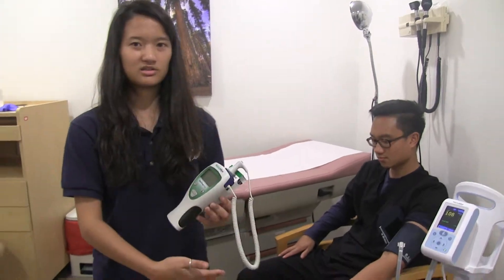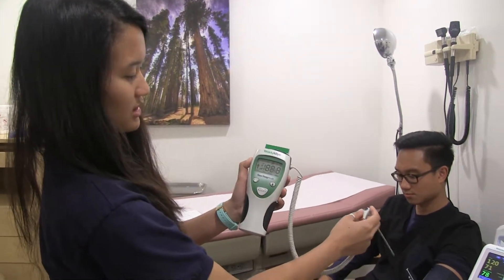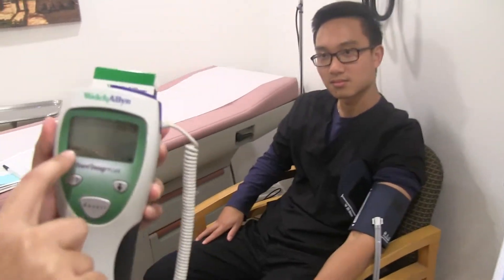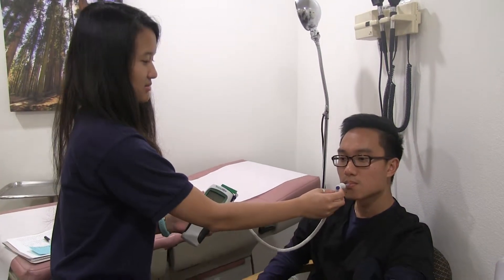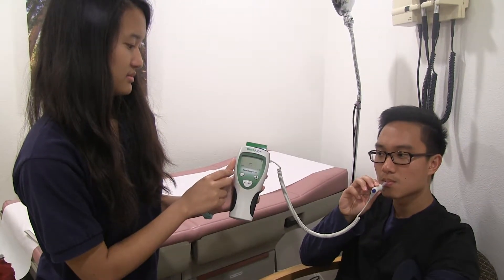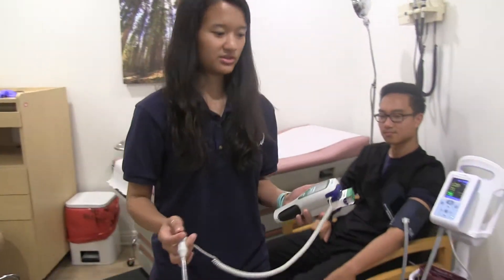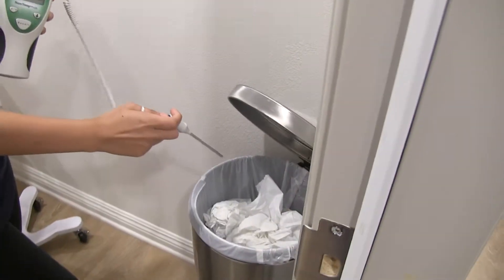While the machine is taking blood pressure, you're going to take the patient's temperature. The temperature probe is right here — remove the probe and stick on one of these plastic covers, pushing it in tightly to make sure it's secured. Make sure it's set to Fahrenheit and set to oral. Ask the patient to put it below their tongue and close their mouth, then hold it with their other hand. If you get errors, that means it's not below the tongue. The reading shows 97.9, which is very normal — the normal range is 97 to 99 degrees. Dispose of the cover using the trash release and put the probe back.